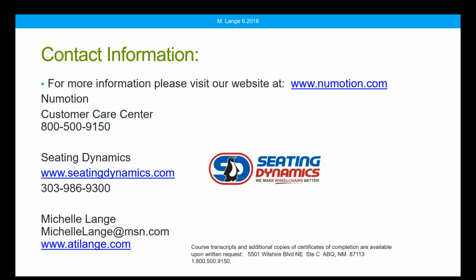If you go to the Seating Dynamics site in particular, if you look on their back page or the dynamic footrest page, there's a list of compatible manual and power wheelchairs. And if the chair that a client has is not on that list, you can always contact them to see if that's something they may be able to accommodate. It may just be a chair that they haven't come across before, and they might be able to accommodate it for you, because they're capable of doing some custom work. So I hope that's helpful.